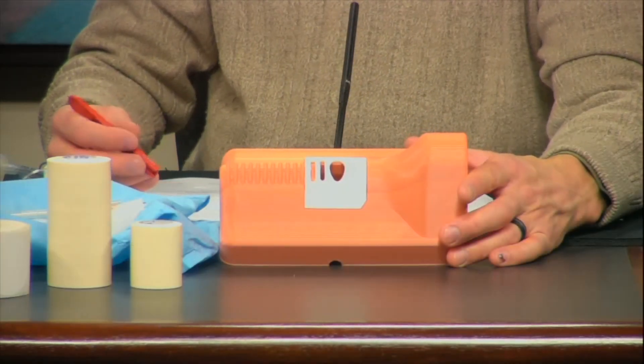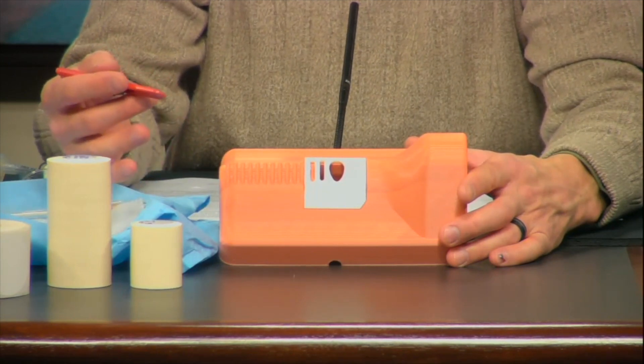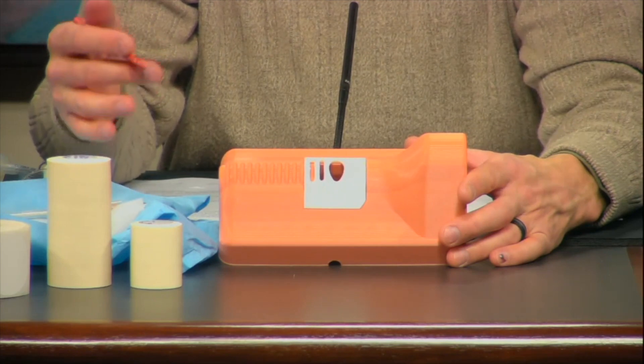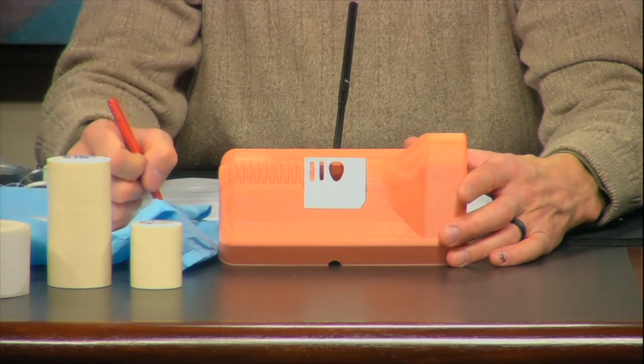The cricothyroidomy unlimited trainer, or CUT, provides a simple and affordable way to perform necessary training for accessing the airway through the neck. It provides a training device that is anatomically similar to a human neck, but specifically designed to be affordable, allowing you to perform repetitions of the procedures at the lowest possible cost.